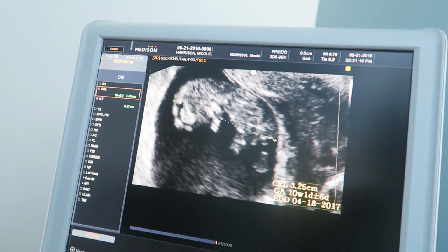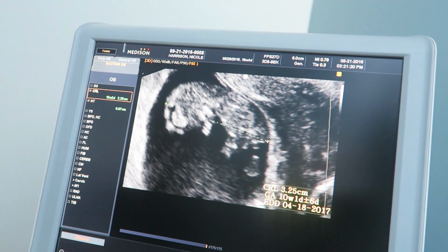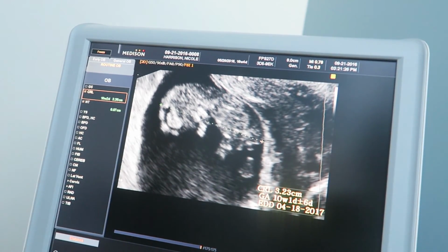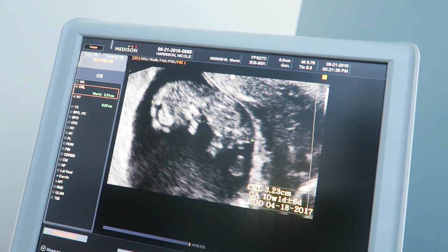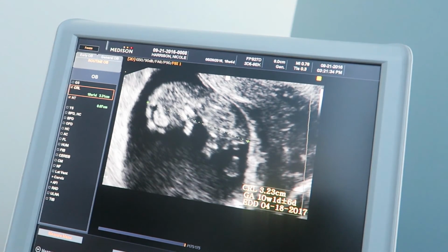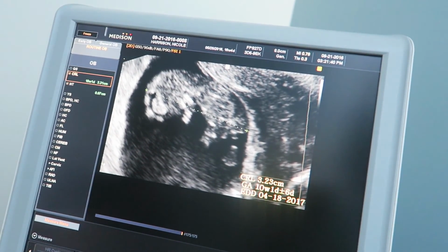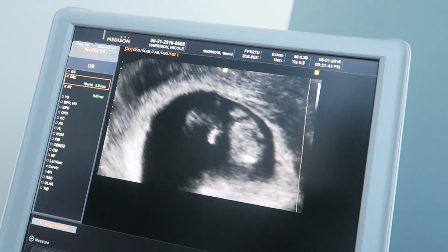Oh, just. So here I'm going to measure it again from top of the head to base of the spine. And this is the consistent measurement. You are 10 weeks and 1 day pregnant with April 18th as your due date. Wow. 4/17/17? No, it's 4/18/17. Oh, really? Yeah. Okay. This is a repeatable measurement. This one changed the date, okay. And with the vaginal probe, you can see the margins a little clearer. The dots are smaller. I see. That's amazing. You can tell just like that.